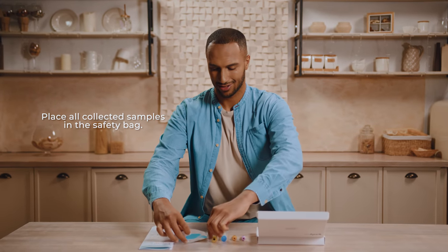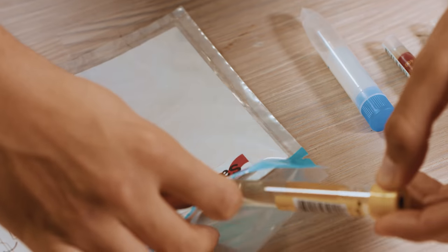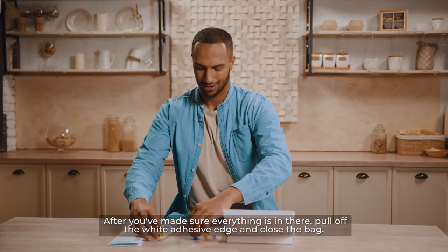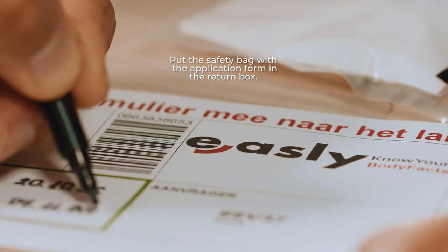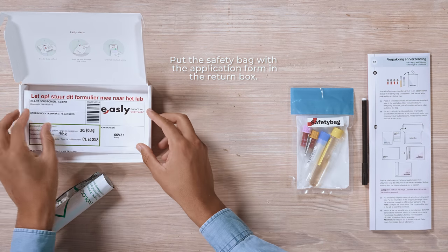Packaging and shipping. Place all collected samples in the safety bag. After you've made sure everything is in there, pull off the white adhesive edge and close the bag. Put the safety bag with the application form in the return box.